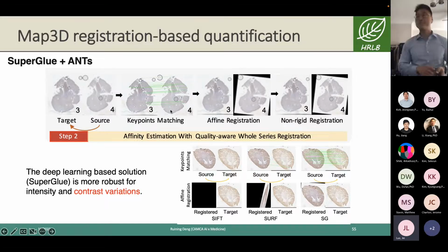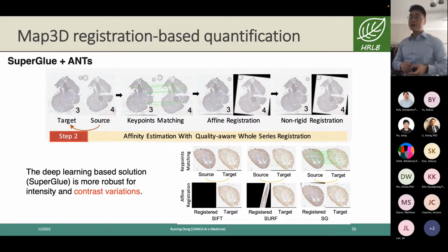Okay. Have you verified the quality of those pairs, to see if they are truly aligned? How do you know they are legit? Yeah, for the evaluation between two key points, we use the distance inside of the pipeline, and also we use registration error to evaluate whether those glomeruli can align well with those key points. So that's the evaluation that we use for registration error.